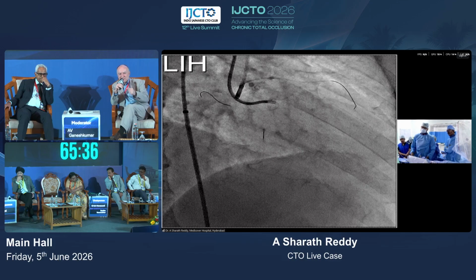So a Gaia 3 is, I think, more powerful. And here you see that there will be a problem because you actually have no marker of your proximal cap. Gaia 2 is already open? Okay. Since Gaia 2 is already opened, I'll just check my luck here.